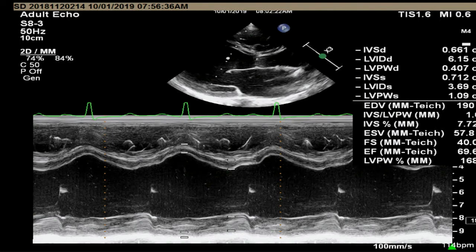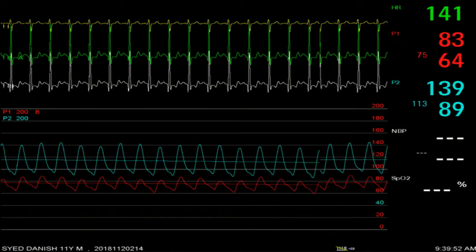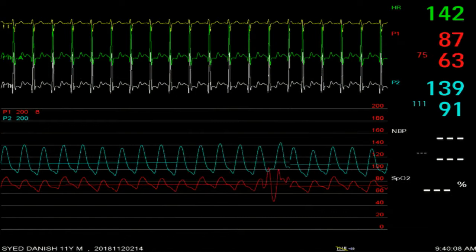The dilated LV measuring around 62 millimeters. So, hemodynamics live. Basically we have done the Qp:Qs. The Qp:Qs is more than 4:1. The pulmonary artery saturations were 92 percent in the distal RPA and distal LPA, giving a shunt of more than 4:1. We are showing the live pulmonary artery pressure is around 84 against an aorta of 139. So right now what we are going to do is cross the AP window live.